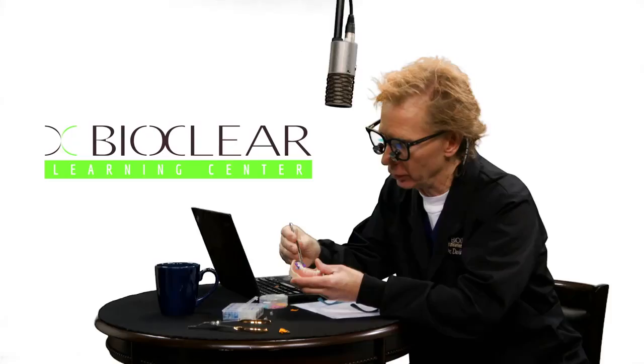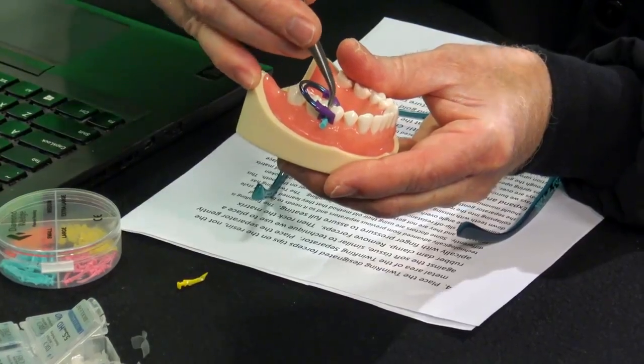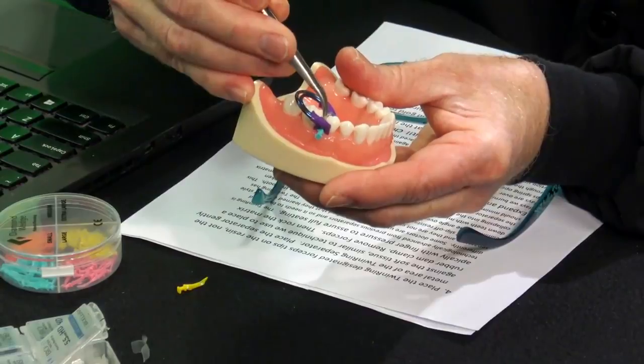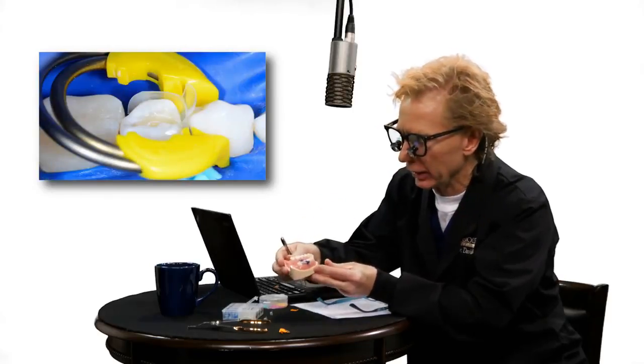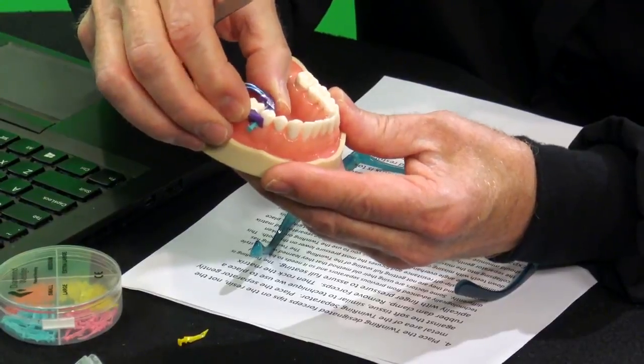Then take the cotton pliers, lift them up, and rotate them to appose or push the matrix against the neighboring tooth. Take your mirror and look from the buccal and from the lingual — make sure it is absolutely apposed with a large contact surface area against the neighboring tooth. It should be lying there passively, held in place by the ratcheting action of the twin ring. Now we're ready to injection mold.